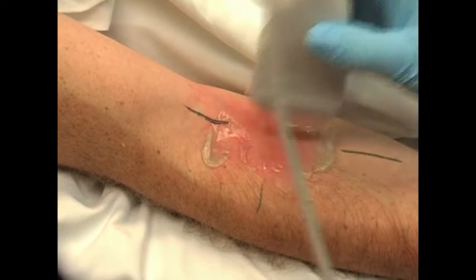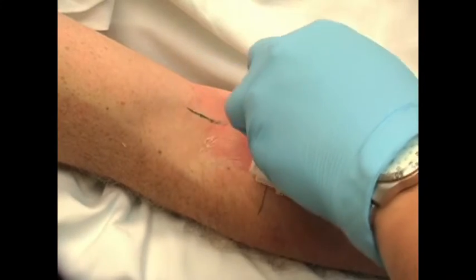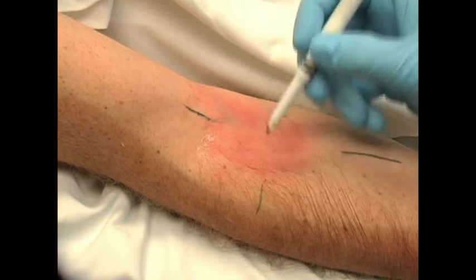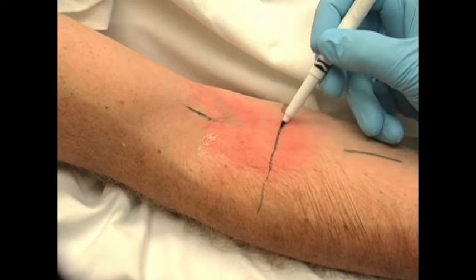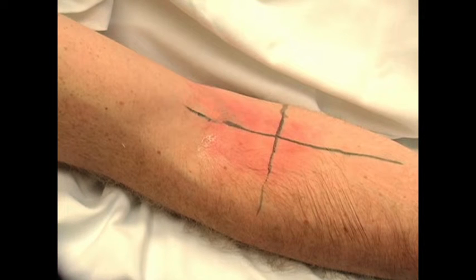Then he's going to wipe off the gel, connect the dots. Smears a little bit, but we can still see our lines. Connects the dots through, and X marks the spot for our incision and drainage.